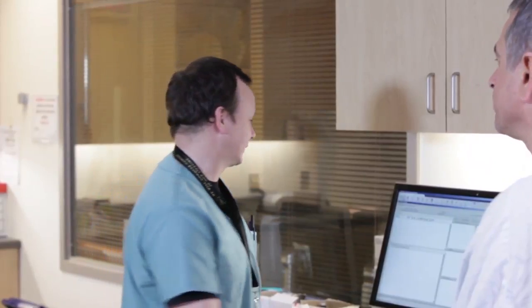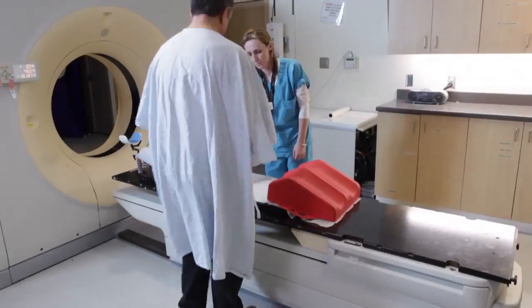A regular question that patients ask is: I've had five CT scans this week, why do I have to have another one? This CT scan is a little bit different — it's not a diagnostic scan, it's used to plan your radiation treatments. Your radiation oncologist, nurse, or therapist will let you know ahead of time what preparation is needed for the scan.